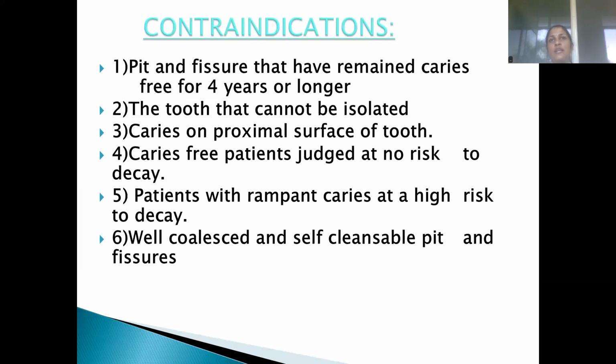Contraindications: if the tooth has remained caries-free for 4 years or longer after eruption, there is no need to go for a pit and fissure sealant. For a tooth which cannot be isolated, where we can't maintain proper moisture control, it's better not to apply the sealant. Then caries on the proximal surface of the tooth.